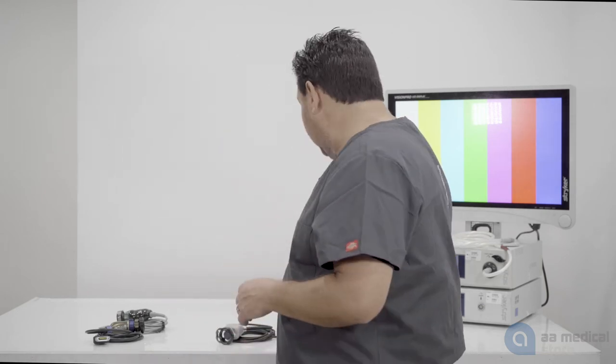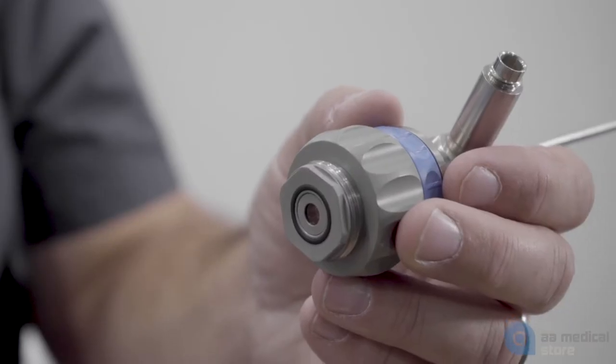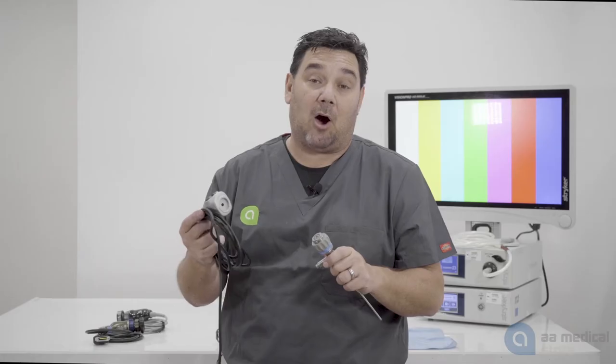One of the biggest differences between a C-mount or direct coupling arthroscope versus an eyepiece arthroscope is going to be the camera head and what you're going to need to be able to use both systems. If you're using a direct coupling arthroscope, the scope itself is going to have threads on it and the camera itself, the coupler will come off and the threads will be inside the camera.